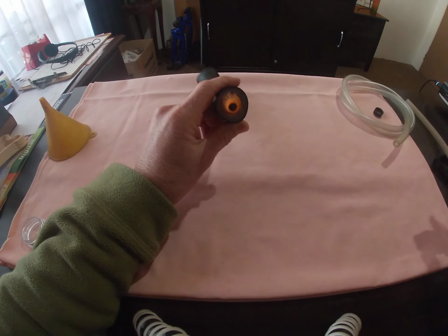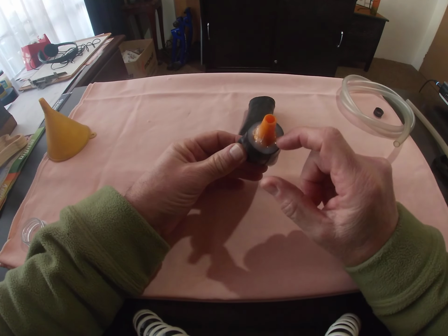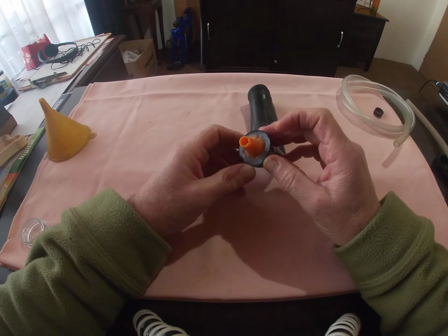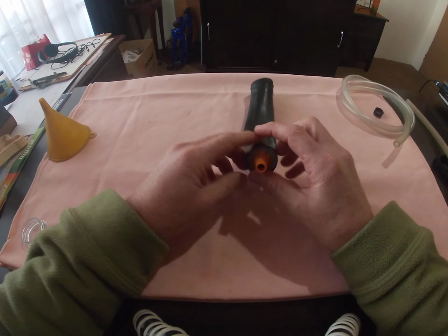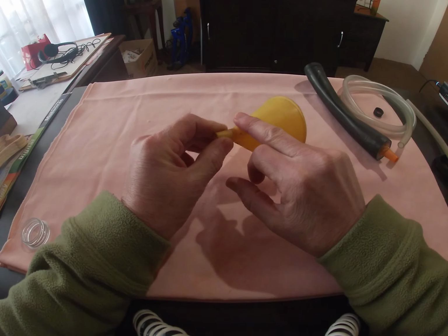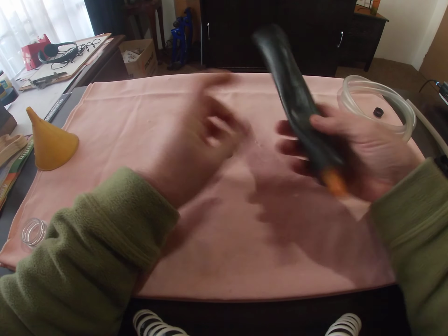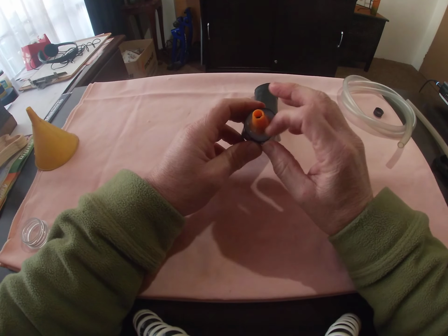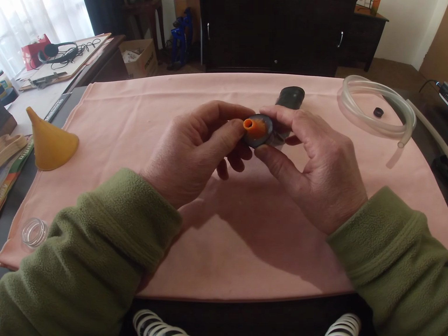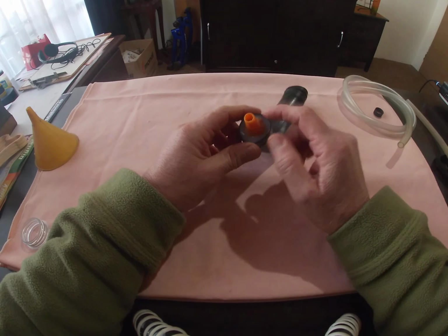Once that's done, you're going to take your hot melt glue gun and melt it in here. Obviously you're just going to do this on the outside because you can't get in there. In order to make a good seal, you're going to take your sanding paper and sand the outside of it very well, because that will make sure it bonds to the plastic better. On the inside, you can also clean it thoroughly with some alcohol, just to ensure a good bond. I had this come out once, so I had to do it again. I only had this come out once, and I probably used this for about 3 weeks.